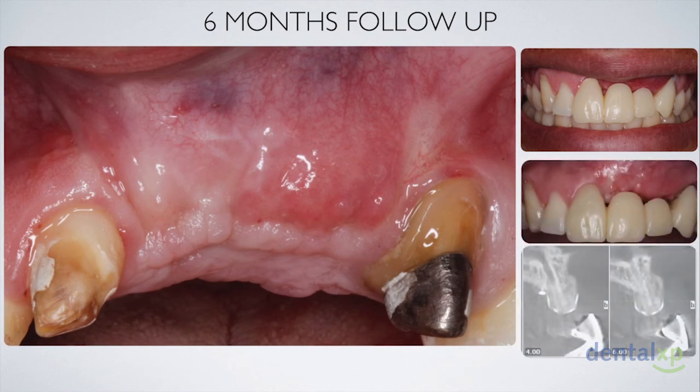Now, if we take a look at the CT scan and at the clinical pictures, we were able to achieve some clinical bone volume. However, from an aesthetic point of view, this really puts us still not in a favorable condition, because we are way below the height of the adjacent papillae of the adjacent teeth, and we have a lot of soft tissue management we need to perform before this case can be considered anywhere near aesthetic.